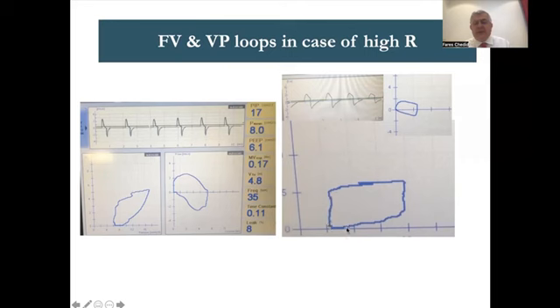He has a severely high resistance because the graph is rectangular. Too much pressure going down without losing volume in expiration. So it's a rectangular graph. Normally the graph should be like that. And this will be the inspiratory resistance, and this part would be the expiratory resistance. So this patient needs suction.